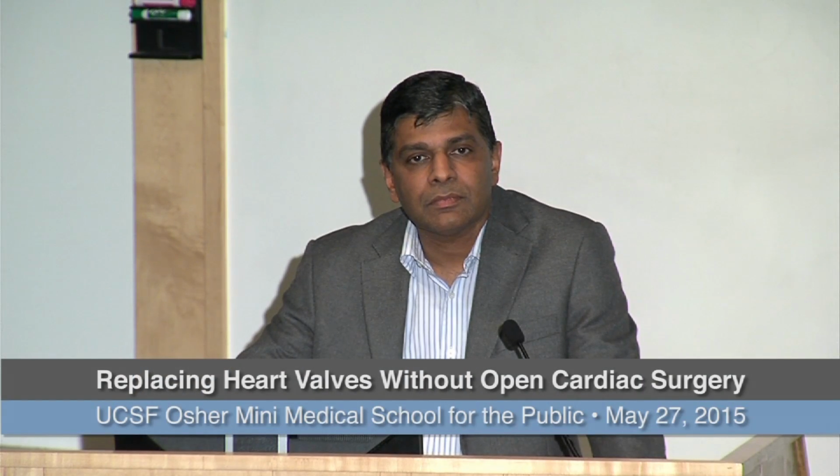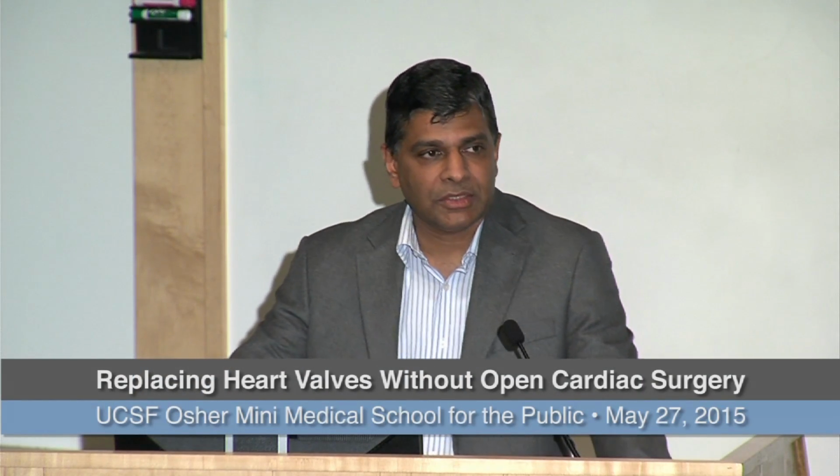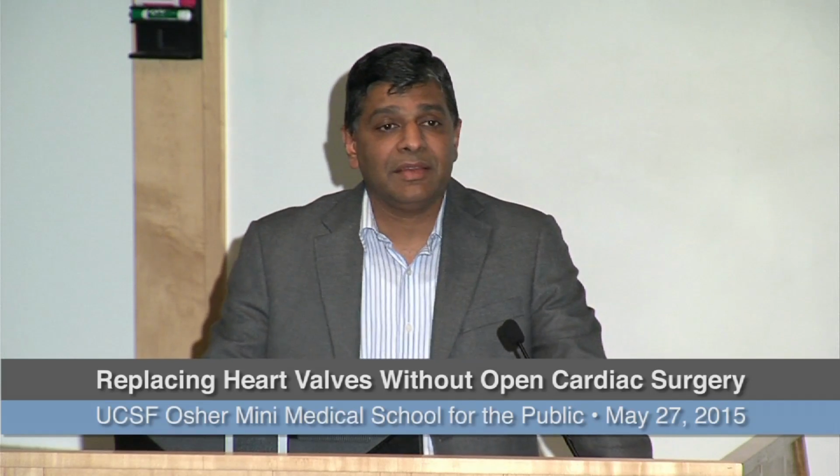I mean, we do know that, but it's a matter of time. What's the lifetime of the implanted valve? That's a good question. We don't know is the honest answer because we don't have as much long-term data like the surgical valves do. But we are coming close to now 7 or 8 year follow-up data, and all that looks good. So I would think this will be like any other tissue valve, a surgical tissue valve, somewhere around 10 years, I think, or maybe longer.